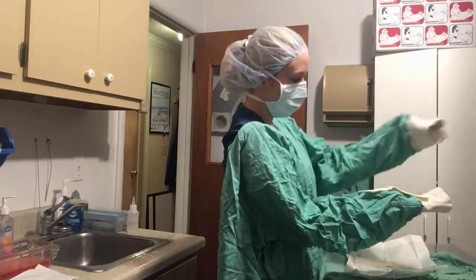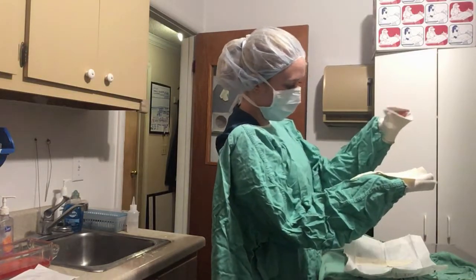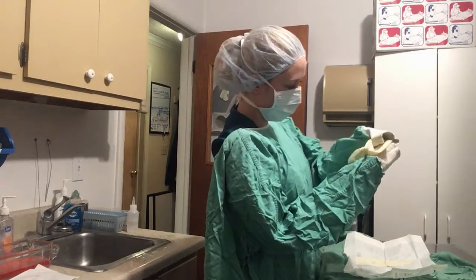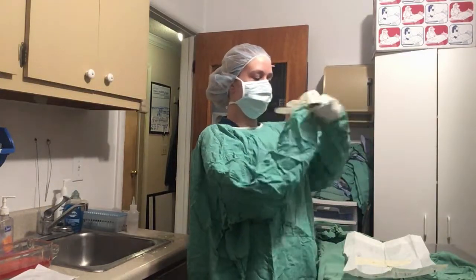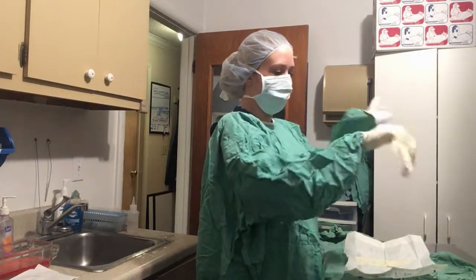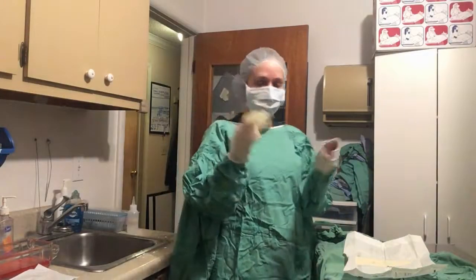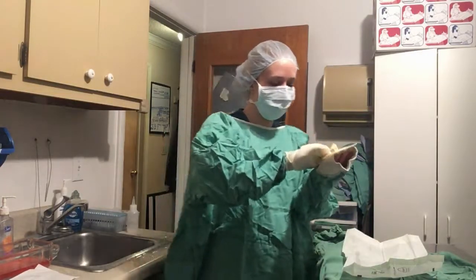And so what I'm going to do is grab the end and then place that over top. And then this can just kind of flop here, that's okay. And so I'm going to go ahead and do the exact same thing on this side.